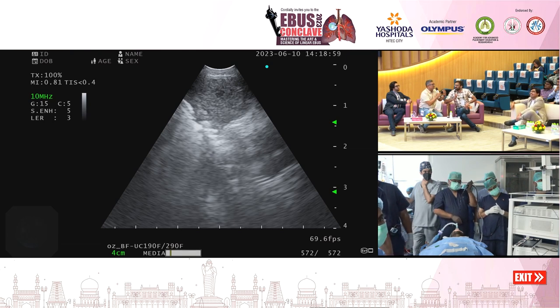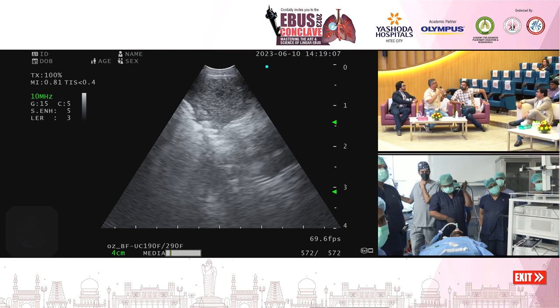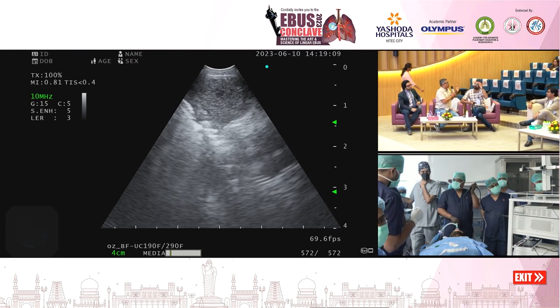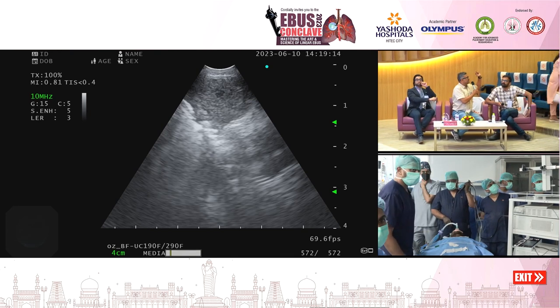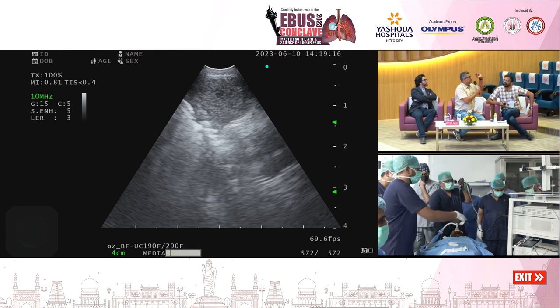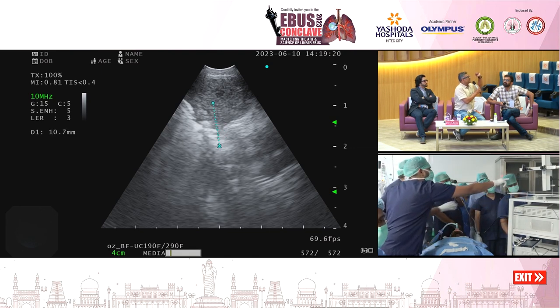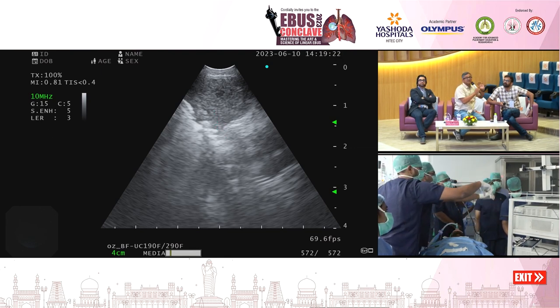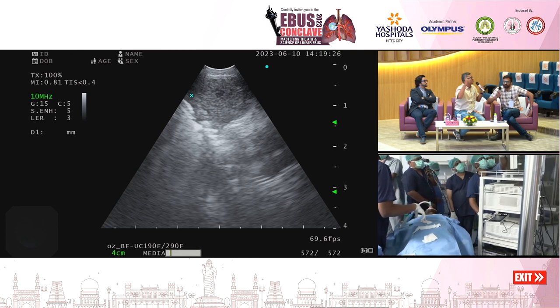Anyway, the reason I wanted the guys to stop there was because I thought briefly we'll talk about the characteristics. Whenever you're talking about lymph node characteristics, seven important points have to be noted. One is the size of the lymph node. The second one is the shape of the lymph node. The third one is the borders. Then you look for central hilar structures and the coagulation necrosis sign. And the last one is the central intranodal vessel. I think they already demonstrated it with Doppler.